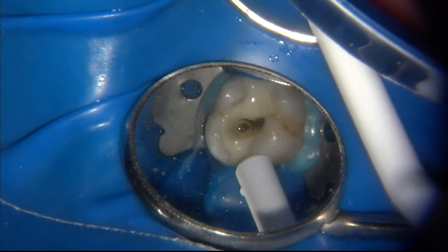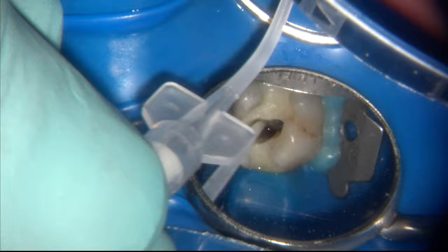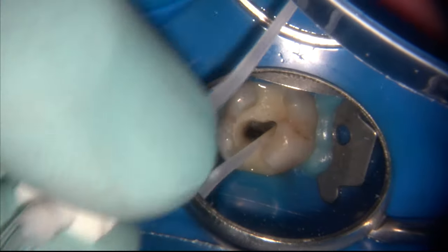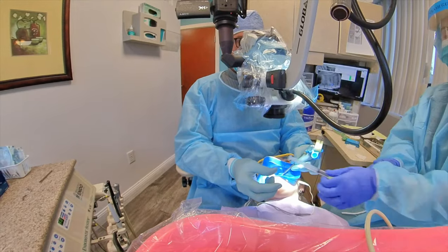After loosening the debris with ultrasonic irrigation, I follow up with negative pressure or suction inside the canal. You can use your own suction, the EndoVac, or — as you see here — the Total Vac, a new negative pressure irrigation system I've been working on. It removes the debris that has been loosened up by the ultrasonic and water from the canal.